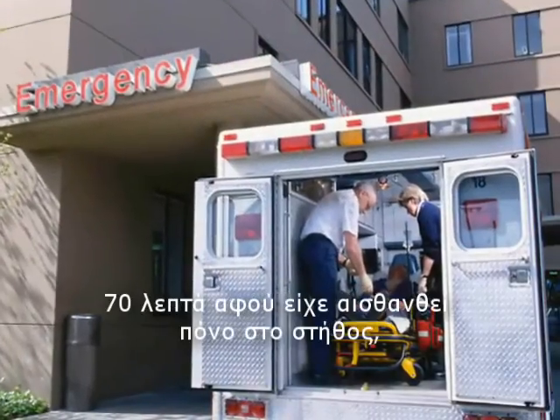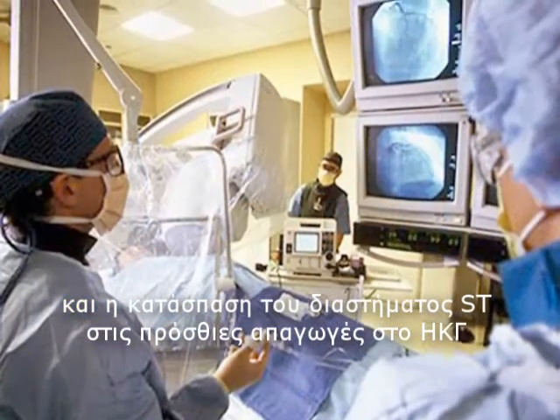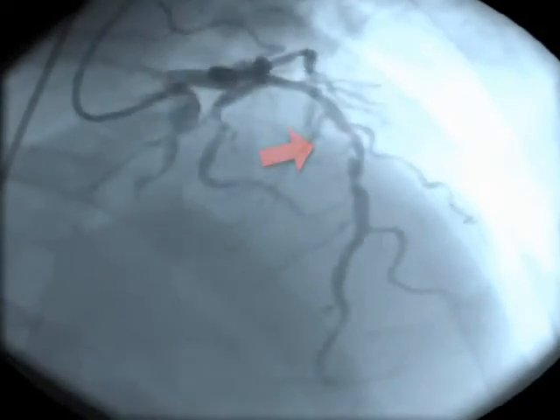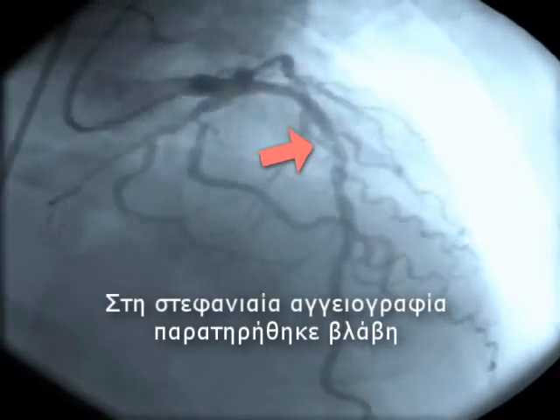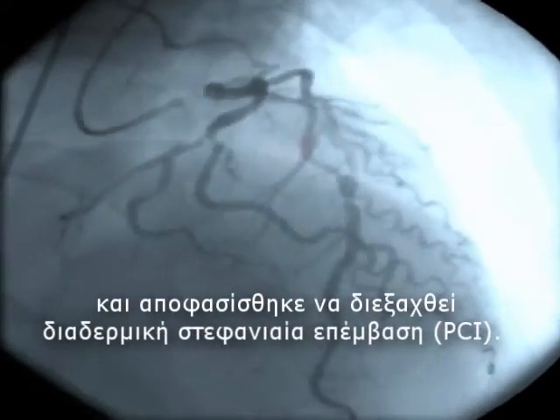A 58-year-old man presented in the ER within 70 minutes of experiencing chest pains, nausea, and diaphoresis. Elevated cardiac enzymes and ST segment depression in anterior leads suggested acute coronary syndrome. Coronary angiography showed a lesion in the mid-LAD, and the decision was made to proceed with a percutaneous coronary intervention.